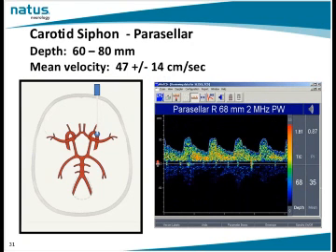After we locate the ophthalmic artery and take a picture at 50, we can begin to increase our depth, and somewhere generally after 60 and before a depth of 74 or so, we are going to encounter the carotid siphon. So there's a lot of variability on where the siphon inserts, or where the ophthalmic inserts into the siphon.